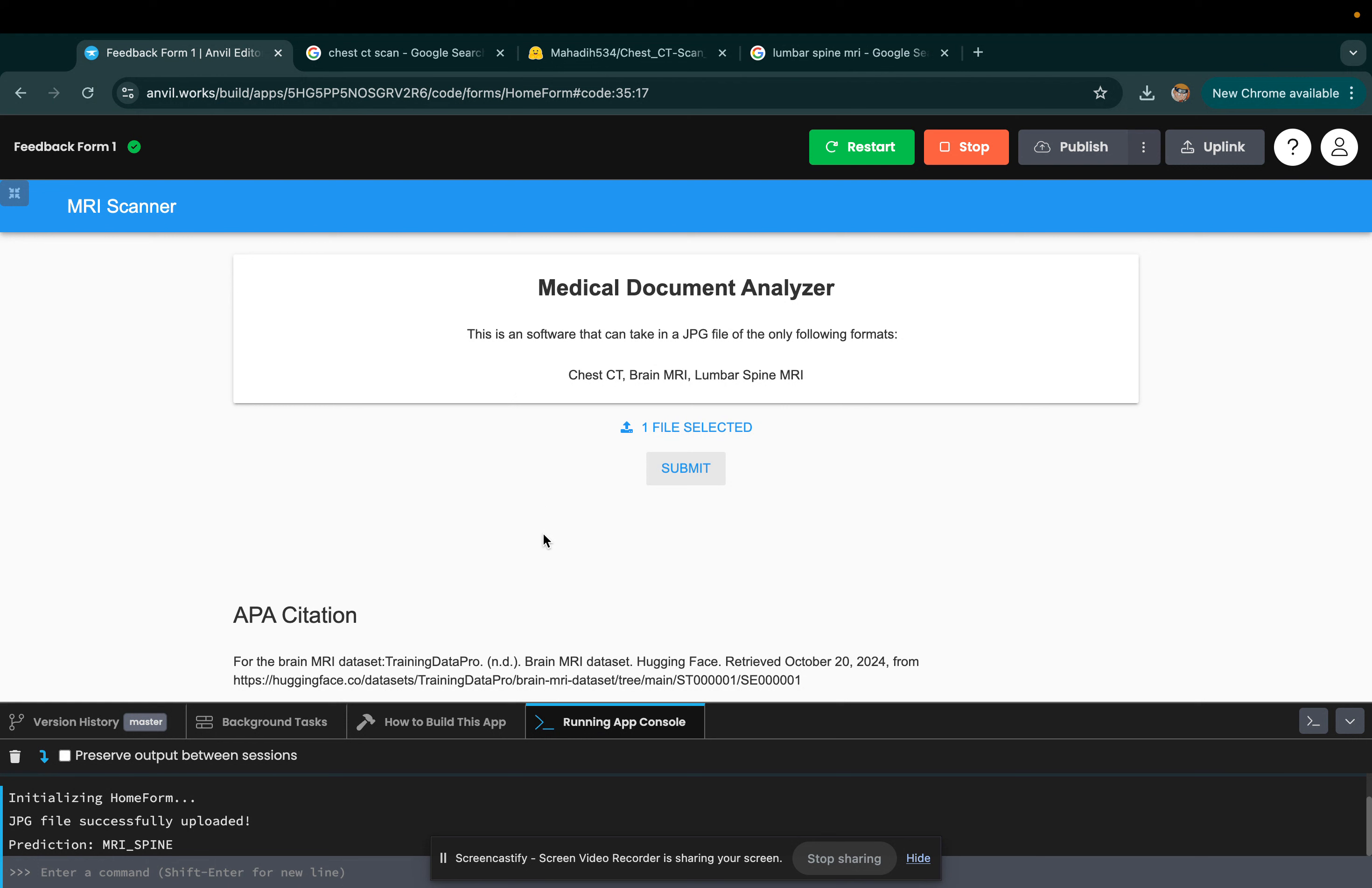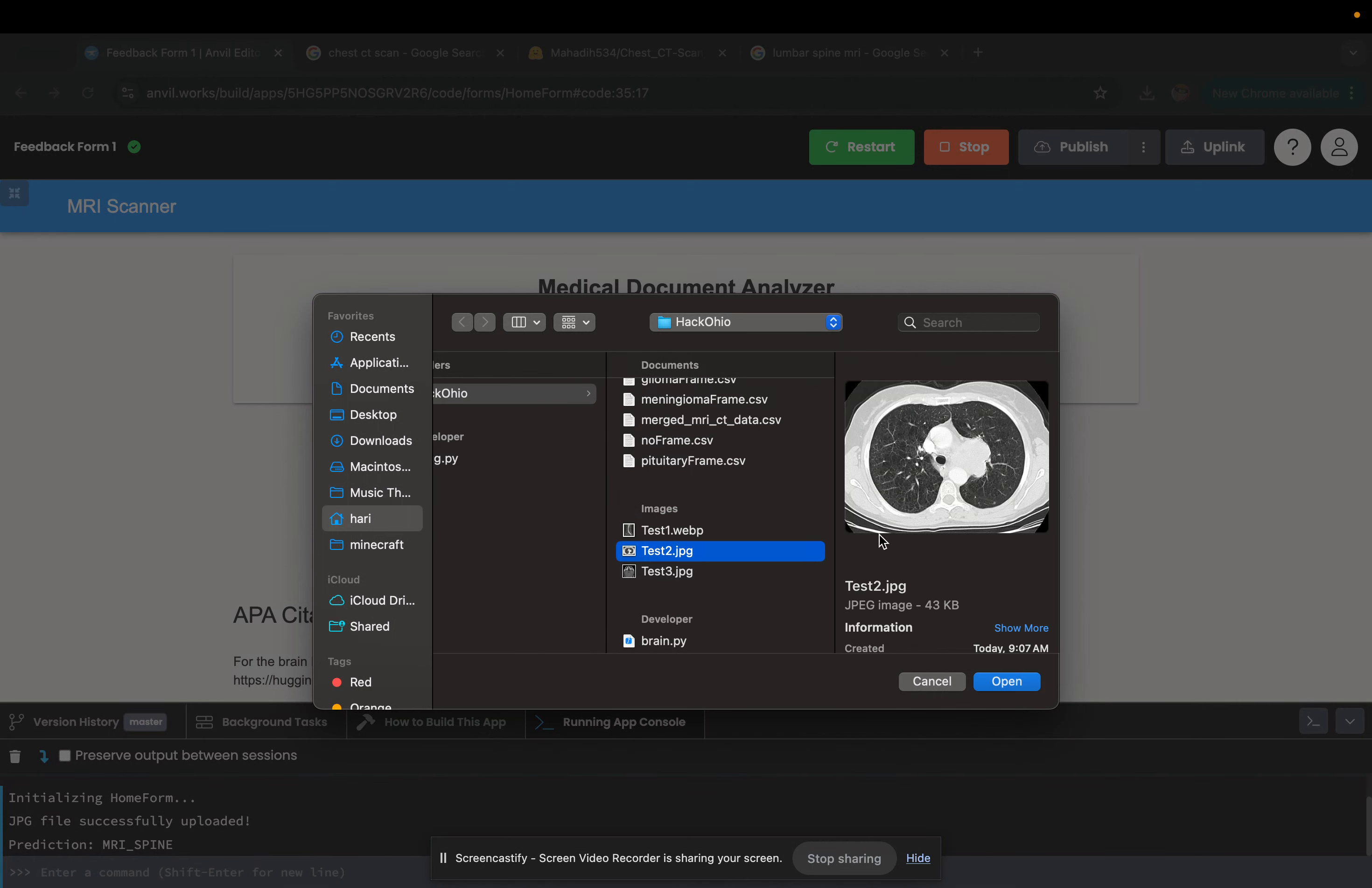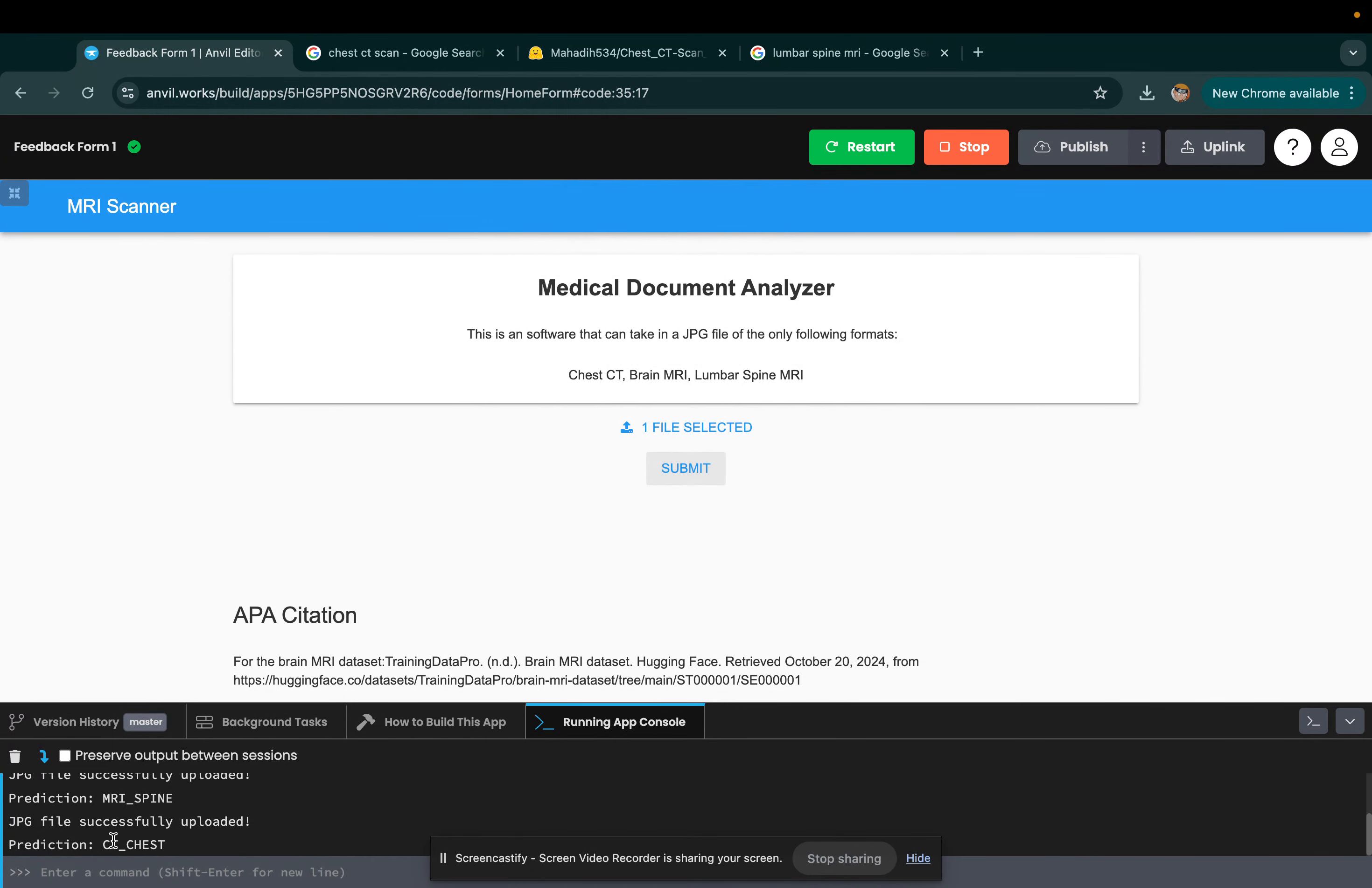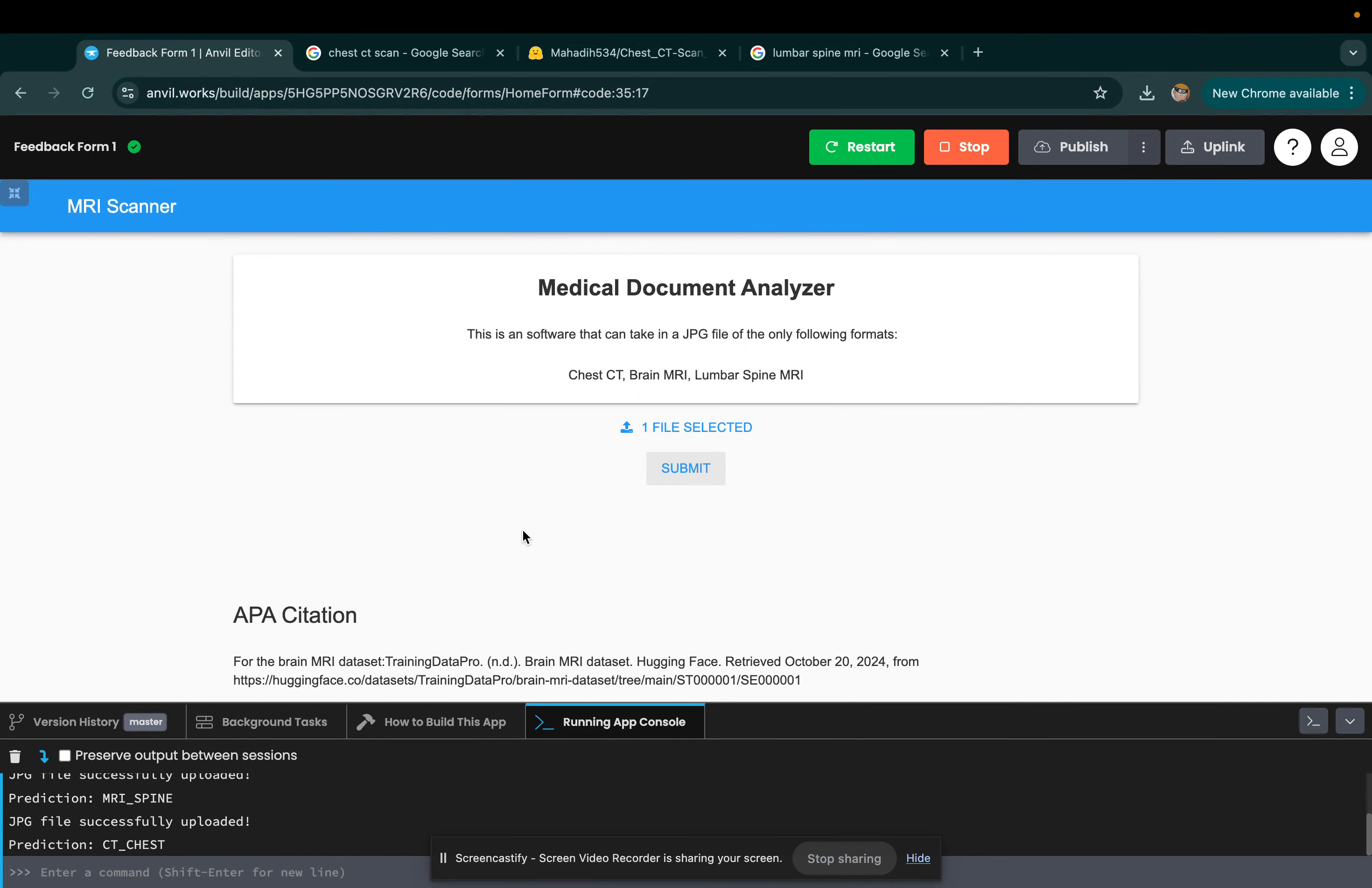It cannot just do spines. We can also select another file here. Let's go to test two. This is a chest CT, so if we submit this, it shows as a chest CT because we used a bunch of chest CT scans.